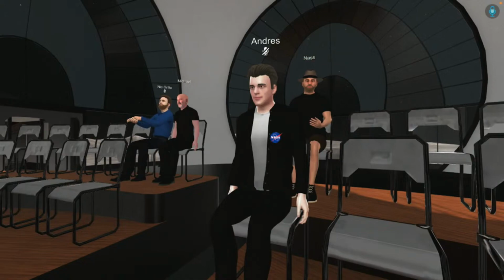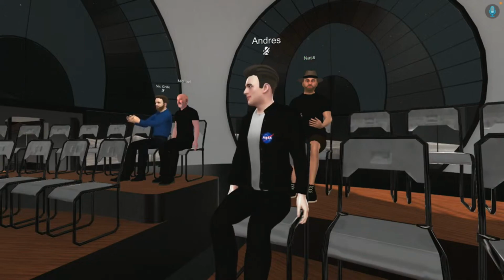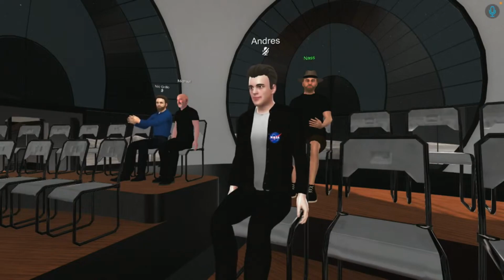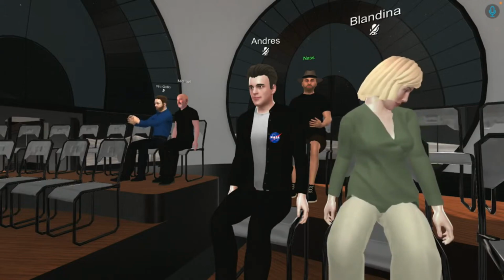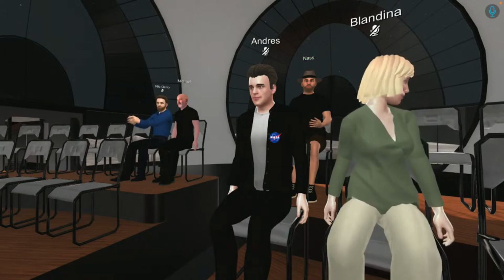I have developed an ILM enhancement filter, which is basically playing with the contrast of the tissues, utilizing the simultaneous contrast concept based on complementary colors, and it highlights the borders of the tissues. I think for the membranes you can even use their autofluorescent properties. I have developed such a filter also in order to distinguish them from the underlying retina.